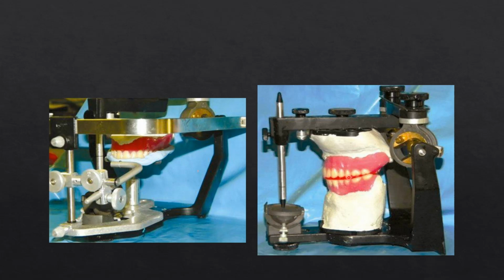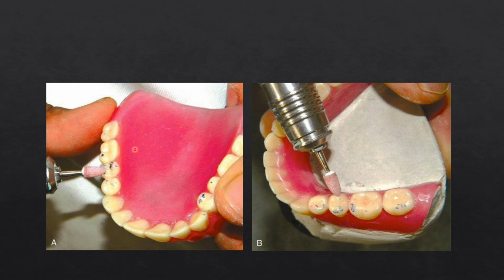Then using the intraocclusal record, the mandibular denture is also mounted, and then the balancing and selective grinding of the contacts of the occlusal prematurities is done. So the basic rule here is called BULL. That means buccal upper and lingual lower.